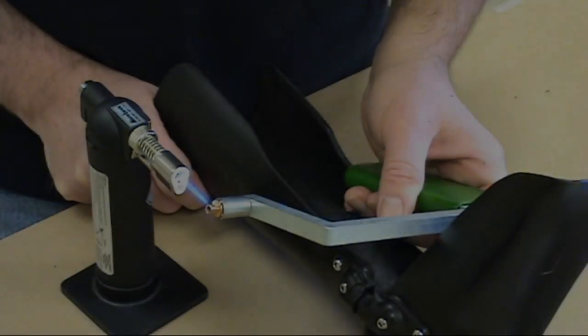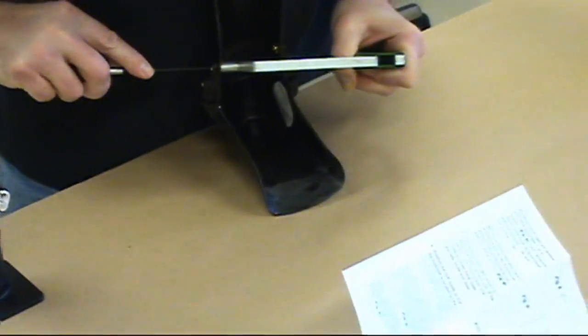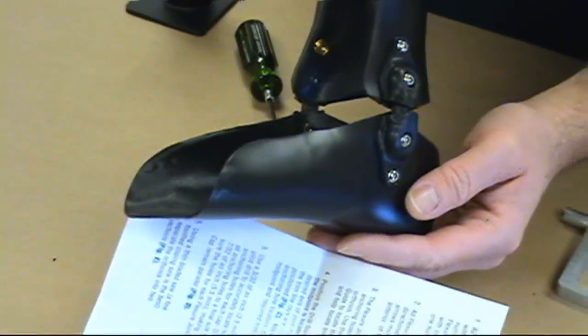If you'd prefer to countersink the flange nuts, follow this helpful fabrication tip. You can either use a counter-bore or a Tamarack Spanner Wrench and heat source. Heating the flange nut will allow it to easily sink into the thermoplastic.